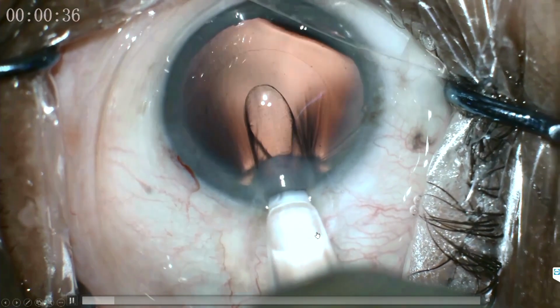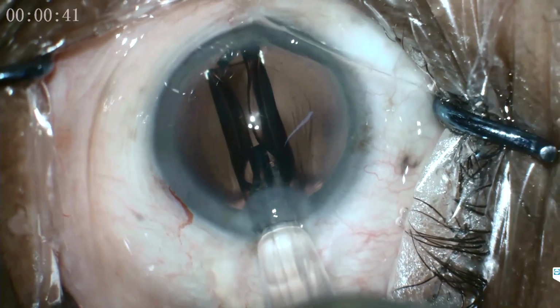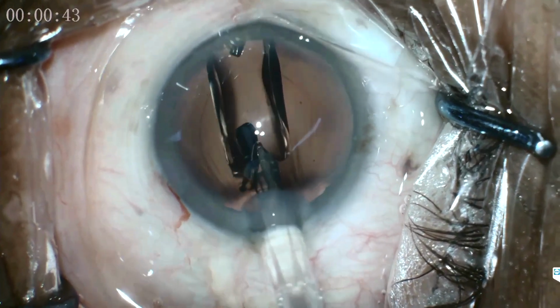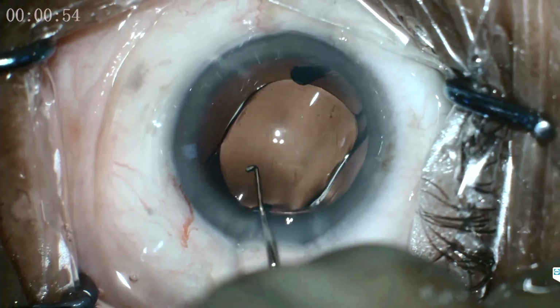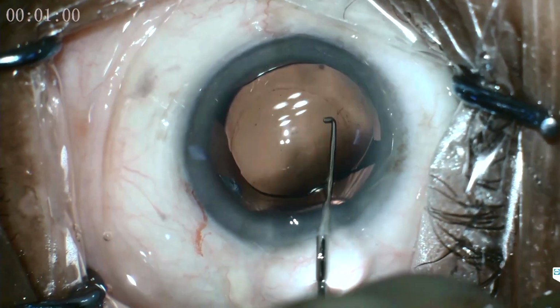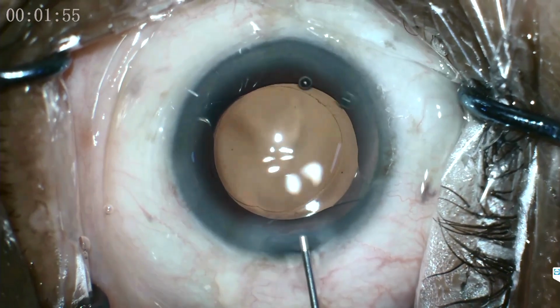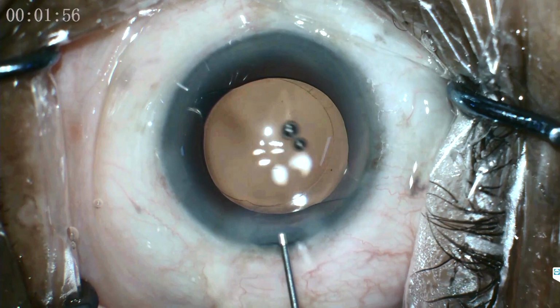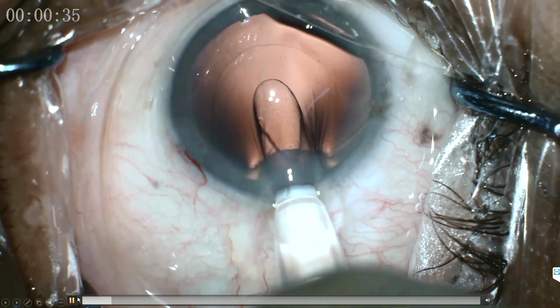So this is a preloaded system. Here we go inside the anterior chamber. Don't go too much, because the lens itself is around 7.7 millimeters. So you rotate. This is a single piece lens, so it goes easily. What I want you to observe here is that we don't support the eye with a second instrument in the side port, and don't forcibly push the cartridge inside the eye. The incision should be just enough to go freely.